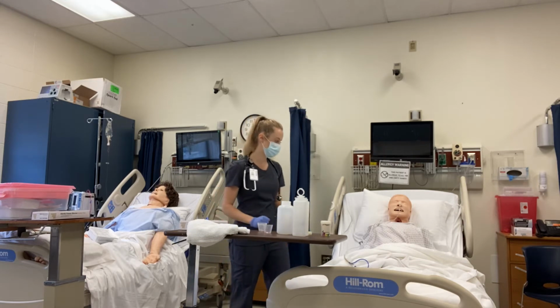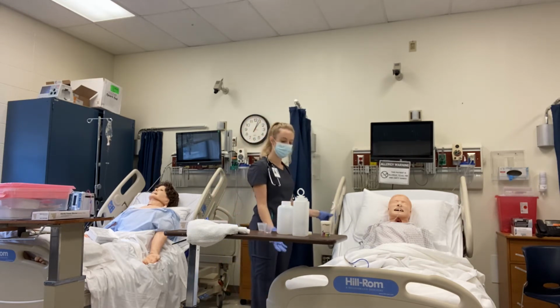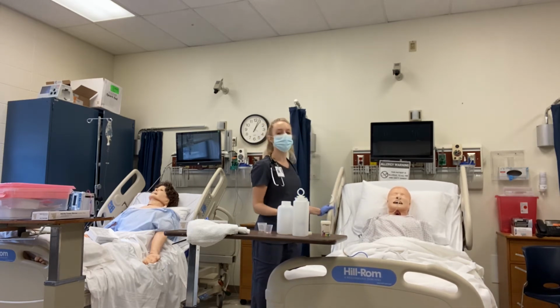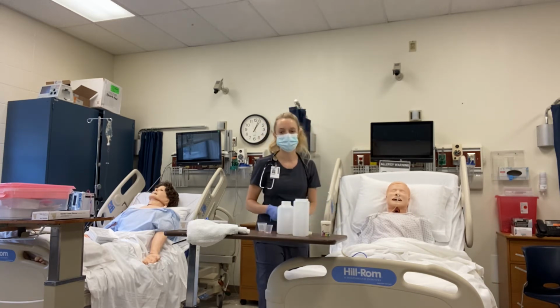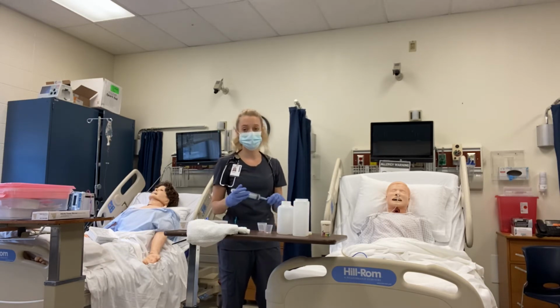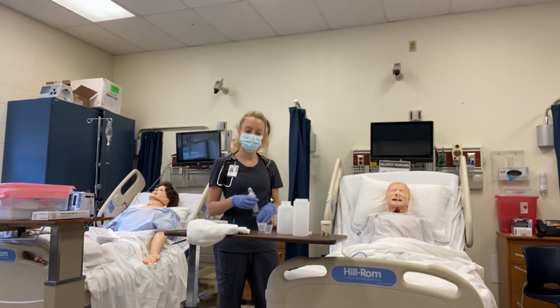Before I administer this medication to Mr. Jones, I want to make sure this bed is at working height, that he is in a high Fowler's position, and I am going to make sure that the NG tube is still in the right place. There's a few ways I can do that. The way I'm going to be doing it today will be to aspirate some contents and check the pH.